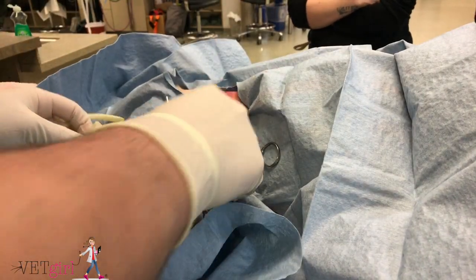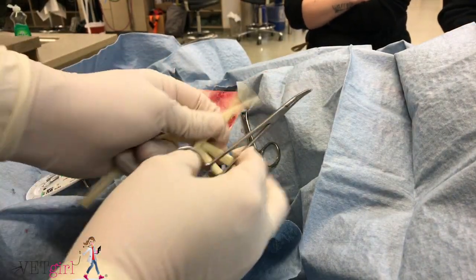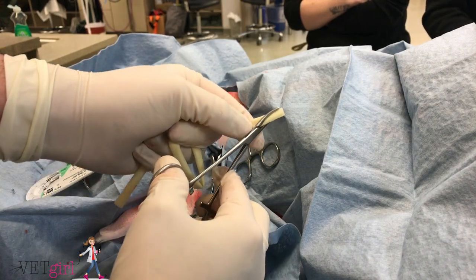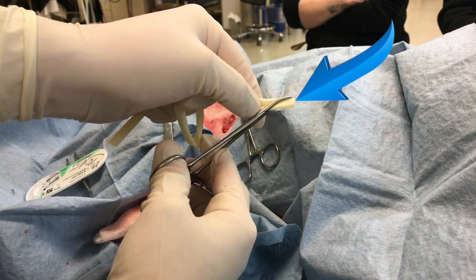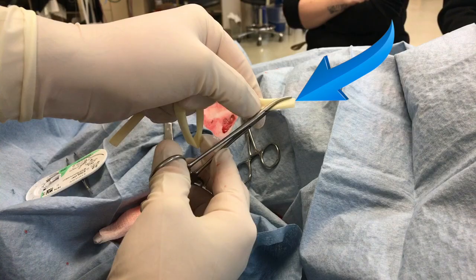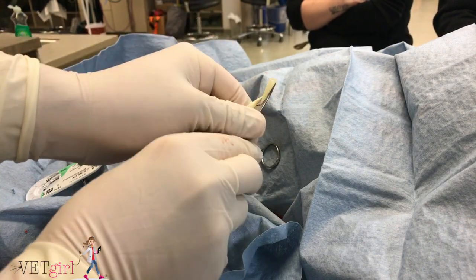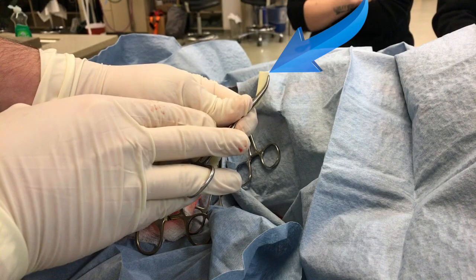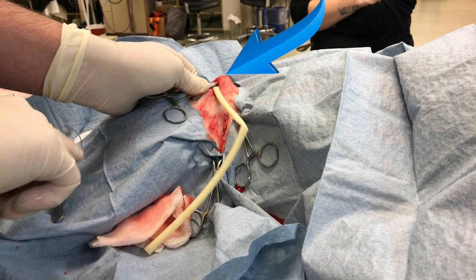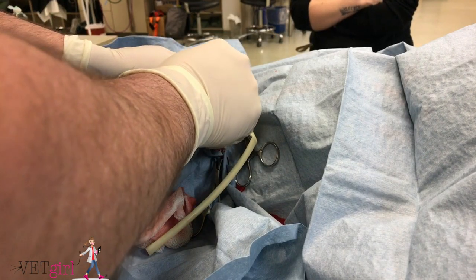As you can see in this video, the hemostat grabs the drain in a specific way to allow a visible free end of the drain, so that when you drive the needle under the skin blindly, you have a landmark — a guide, notably the hemostat — which allows the clinician to blindly course the needle through the drain using the ventral aspect of the hemostat as a guide.